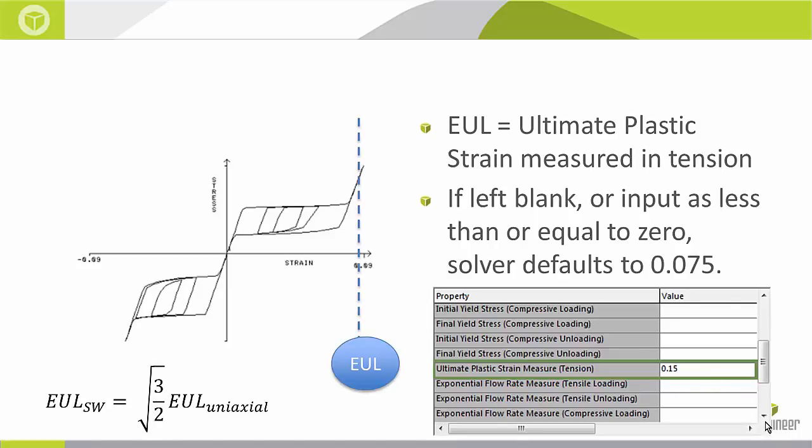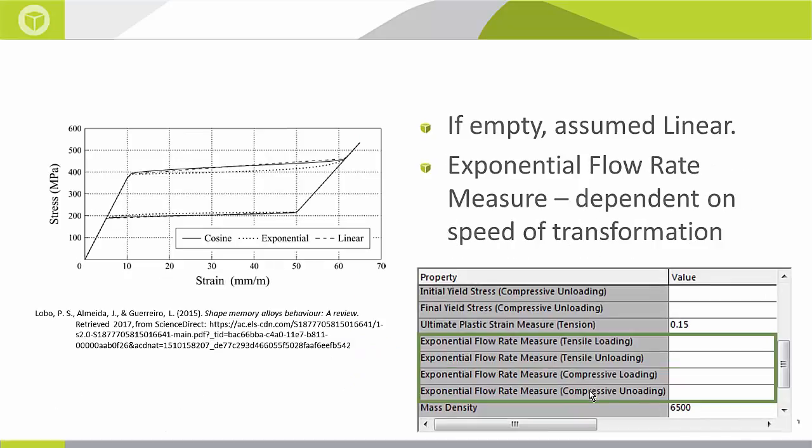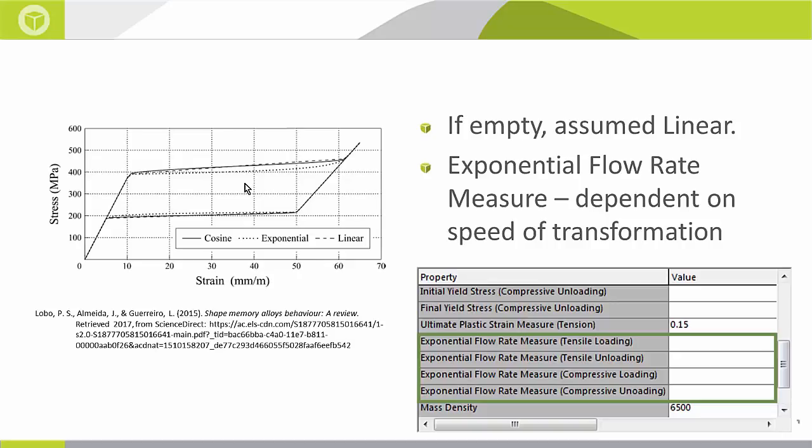Then if I scroll down some more I would get to the exponential flow rate measurements for tensile and compressive loading. Taking a look at this picture over here between the dots and the dashes in the straight line you can see different mathematical interpolations between the two yield stresses produce different curves. Generally having an exponential flow rate measurement does create a more accurate material model. However not all shape memory alloys are very dependent on the speed of transformation. In terms of SOLIDWORKS simulation as long as you have the eight yield stresses and the ultimate plastic strain you don't technically need the exponential flow rate measurement. As the slide says if you leave this blank SOLIDWORKS will assume a linear line between the two yield stress points.